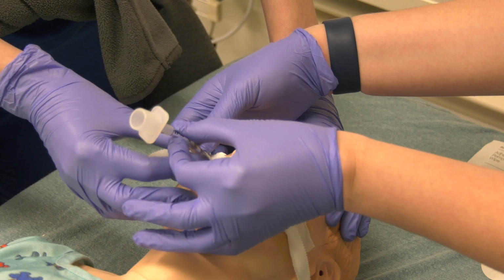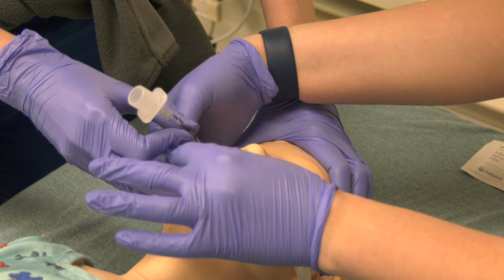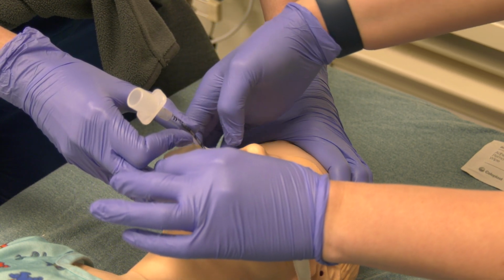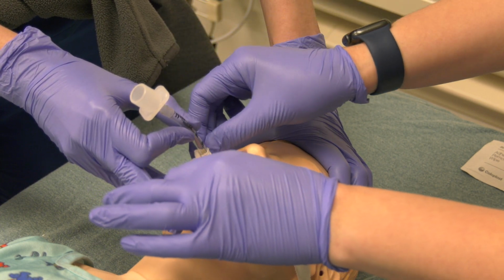And now I will take the top piece on this side, and if you don't mind moving your hands just a little bit, I have the tube. Thank you. Is that better? Yes. And then I will begin to wrap this piece around. Try to make sure that you get all the way up and there's no gap on this side.